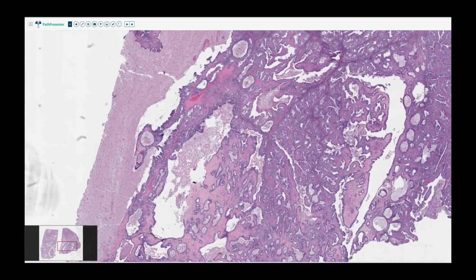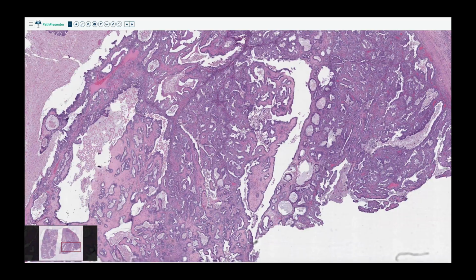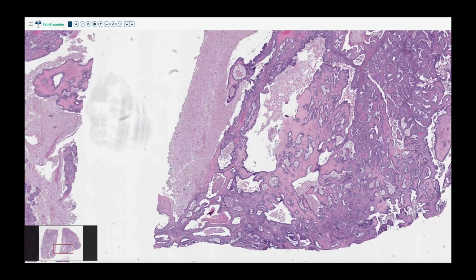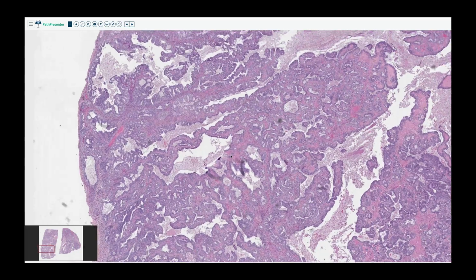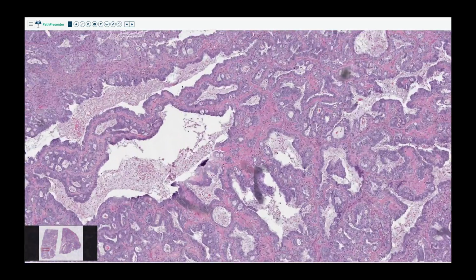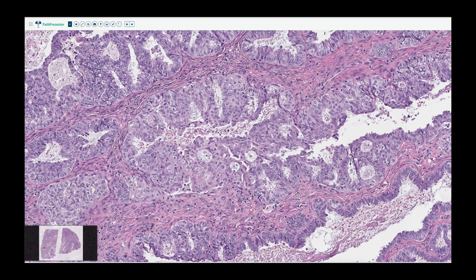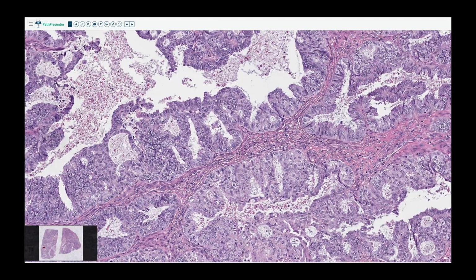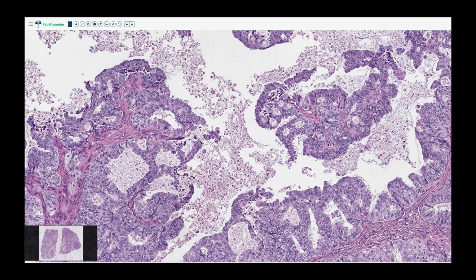This is good because it also has some of that fibrous stroma, but you start to see these glands are getting a lot more complicated, branching. It always helps for endometrioid adenocarcinoma to see some nice squamous morular metaplasia, but you don't always get that gift from the tumor to tell you the tumor type. But you can see here this glandular complexity, there's cribriforming and then apoptosis, mitotic activity, and more nuclear pleomorphism than that case we just saw. So this is a good example of an endometrioid adenocarcinoma arising in the ovary.